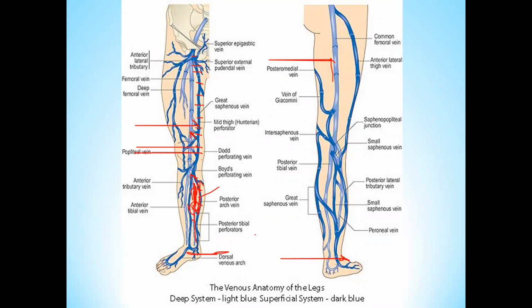You can check the compressibility of the femoral vein at the adductor canal by compression. Similar compression, but now much more compression will be needed as compared to the proximal area.